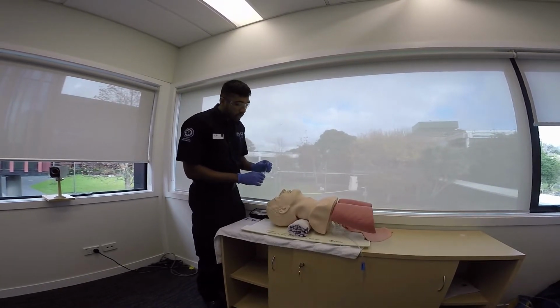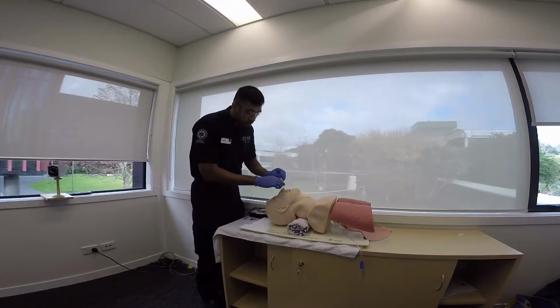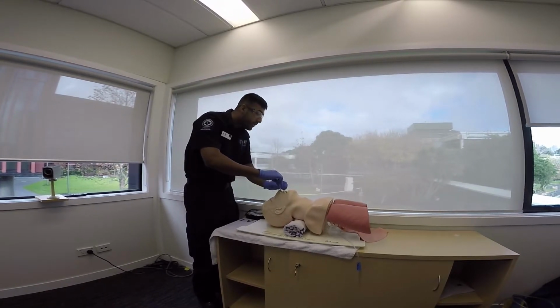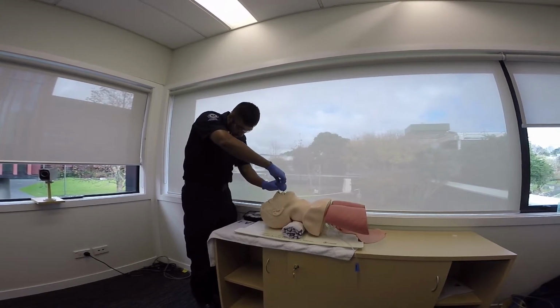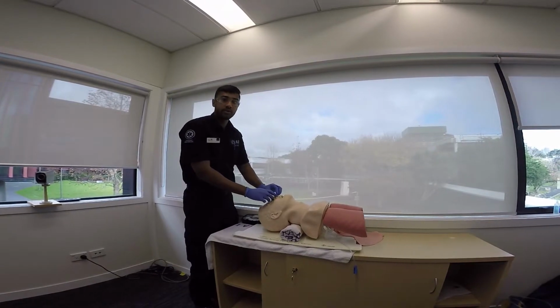And whilst inserting it, you want to insert it directly into the patient's nostril, ideally the bigger of the 2 nostrils, and just place it in like so. If any resistance is encountered, you can twist it at a 180 degree angle, all the way until the nostril sits flush with the flange.